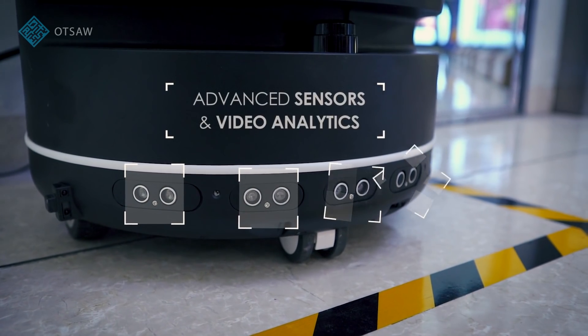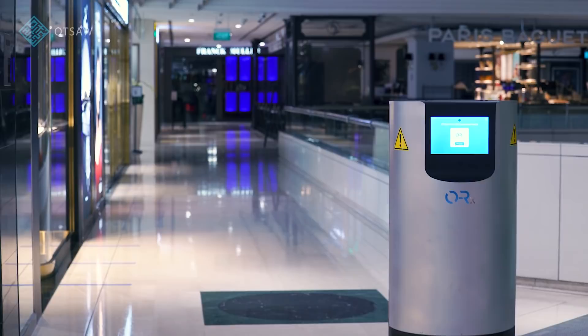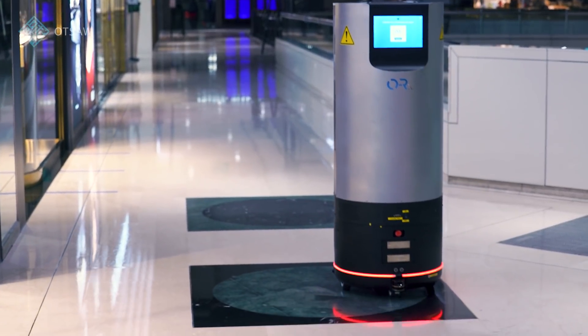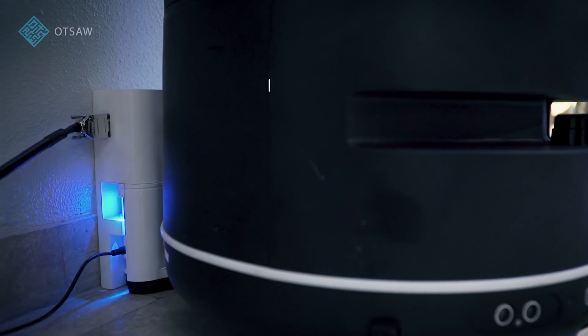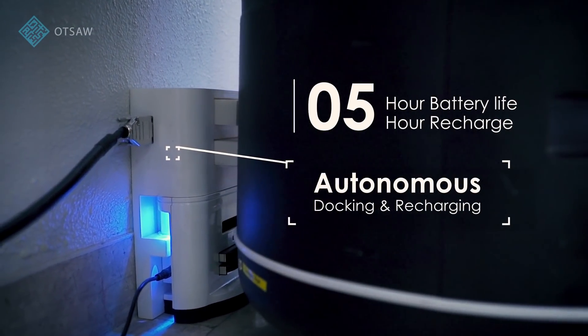The safety features include advanced sensors and cameras based on analytics, allowing for obstacle avoidance and human detection. And with a five-hour battery life and five-hour charge time, ORX will autonomously dock and recharge when needed.